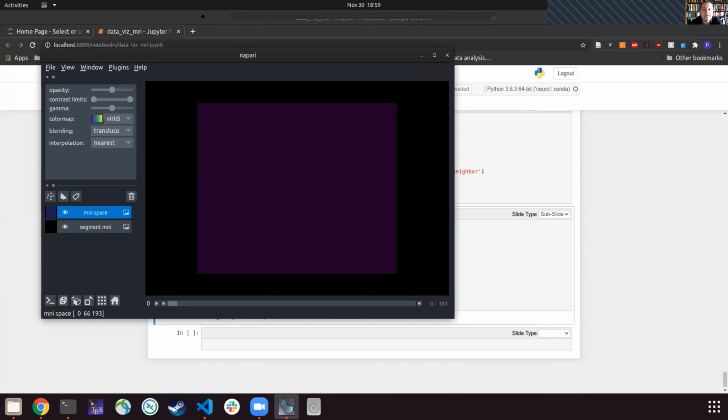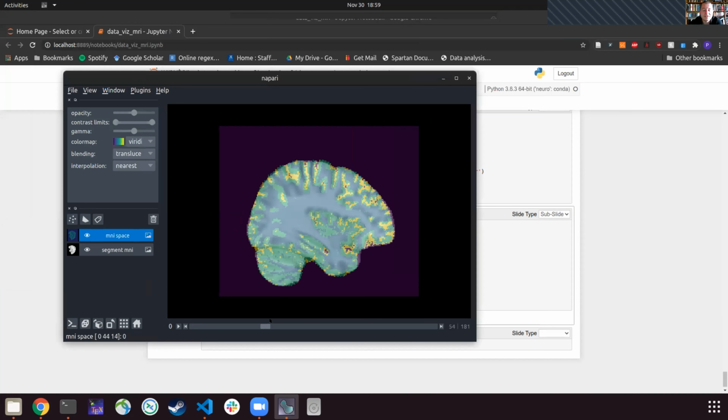And so then what we can do is take this image and extract information from our template space image. We can run group analyses by stacking all of the images on top of each other and running a voxel by voxel analysis. So kind of think like doing a single t-test only 11 million times. We can go and do classification because now we know that all of the different portions of the brain are going to be in the same space.